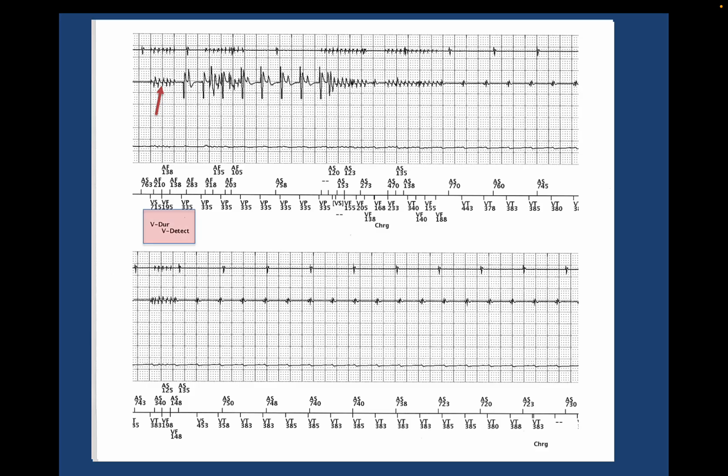And in this case, as is the case with most ICDs, ATP is delivered quickly as the device is either charging or before it starts to charge. And in this case, you see ATP delivered, V-pace, V-pace, V-pace. And at the end of the anti-tachy pacing, the device is going to say, all right, did that work? It's going to look at the patient's rhythm, and it sees cautery again. So now VF is detected, and there's no doubt ATP didn't work, so the device starts to charge.